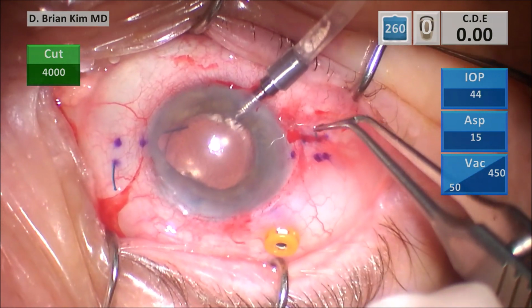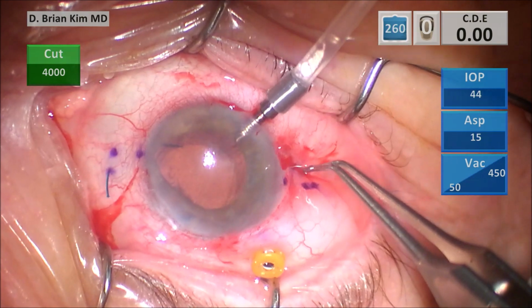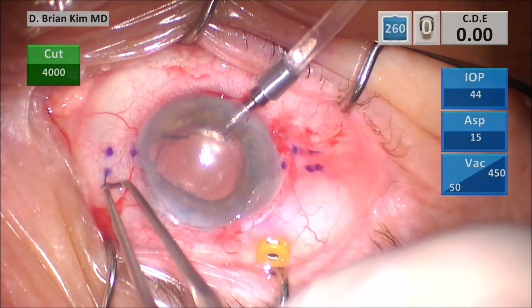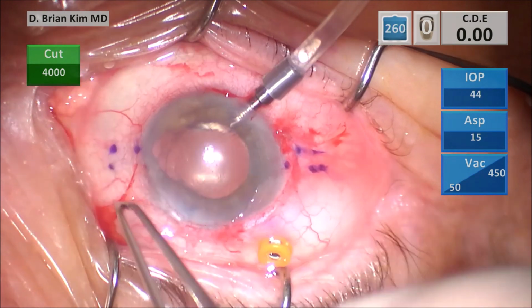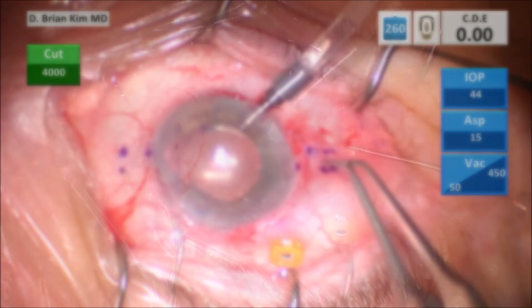When you see the haptic pointing up, that means it's a very bad technique, and the lens is actually going to be sagging down. The optic is going to sag down if the haptic is pointing up. And that means you have an inadequate scleral shelf. So again, a well-centered and positioned lens.